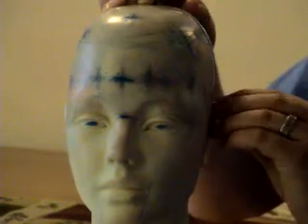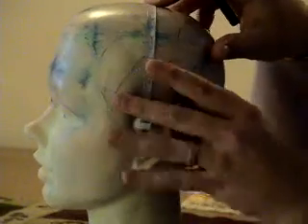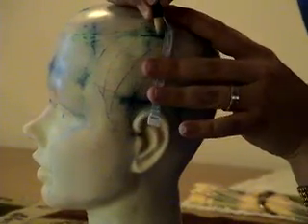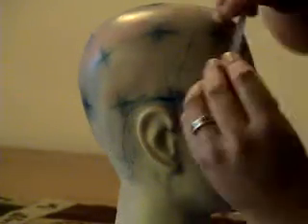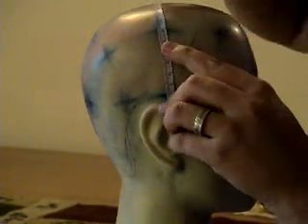You're going to take the measurement between here and CZ, which is going to be 12 centimeters, and you're going to make a mark half of that, which will be 6, right across there. We're going to do the other side. Half of 12 again is 6.